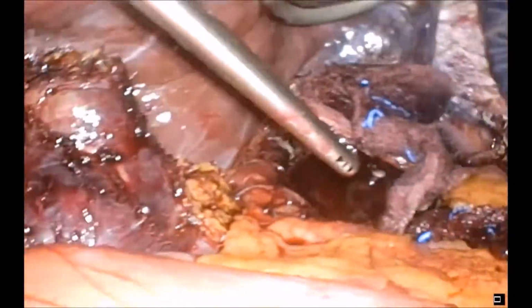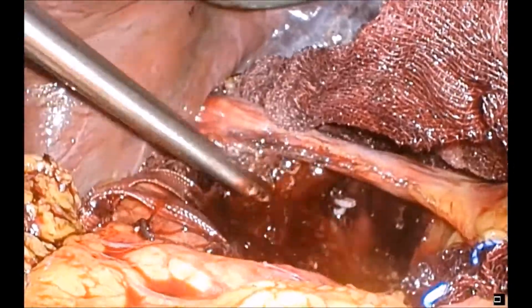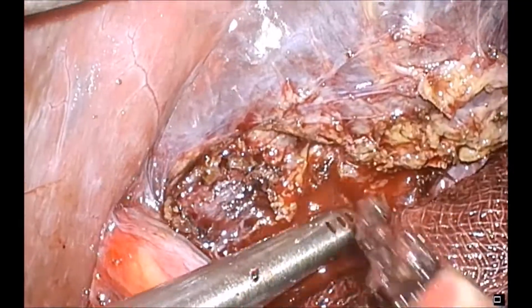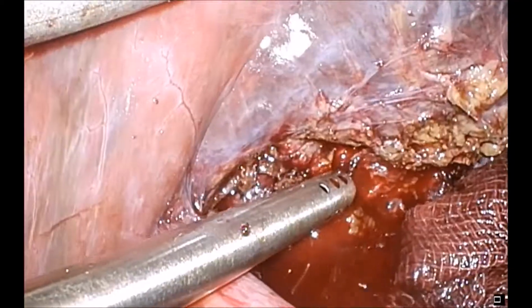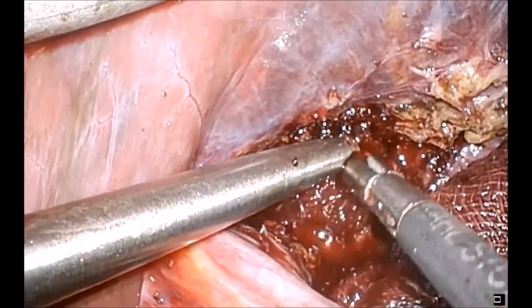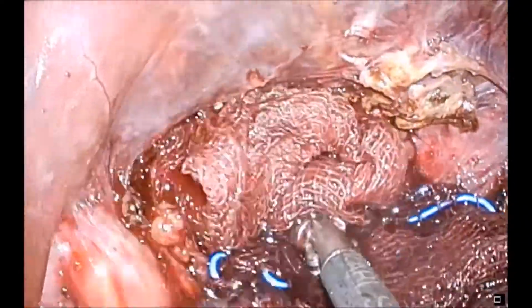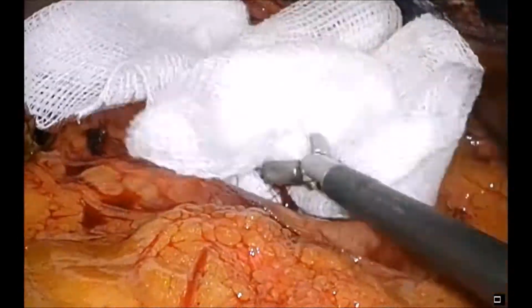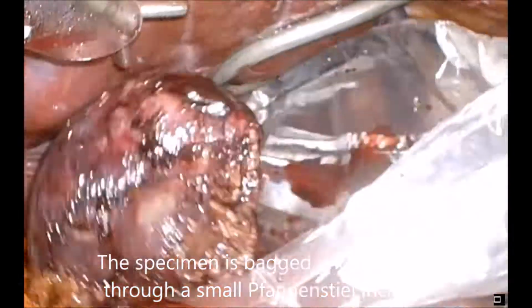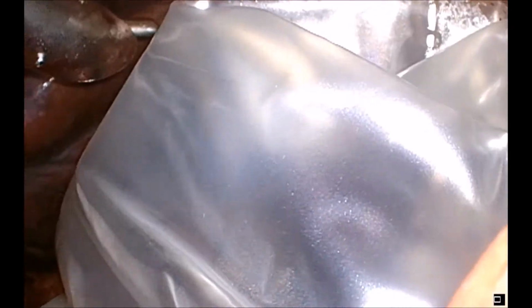And at that point the caudate lobe's been detached. The hepatic artery is still patent. There's a troublesome bleeding point on the parenchymal surface, which doesn't immediately get controlled, so we pack that away, while we place the specimen in a bag and remove that through a small Pfannenstiel incision.